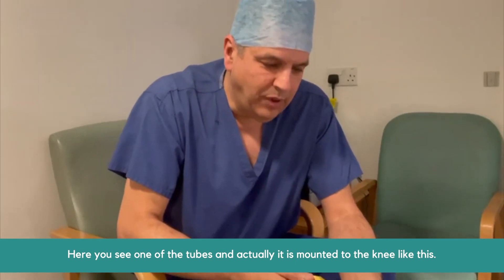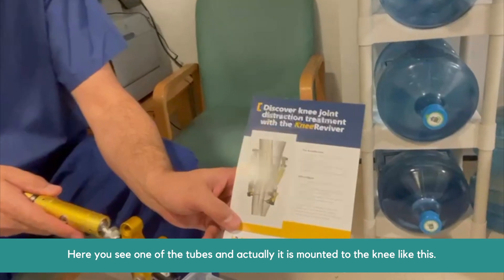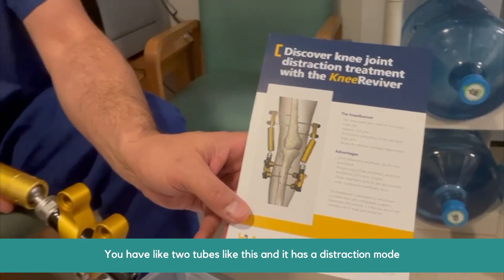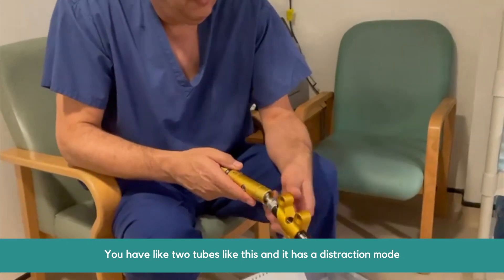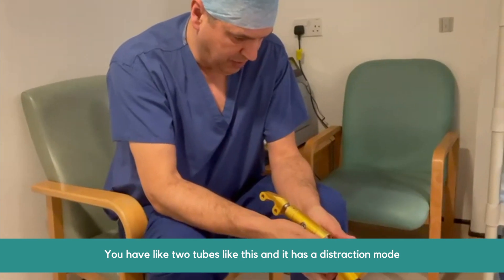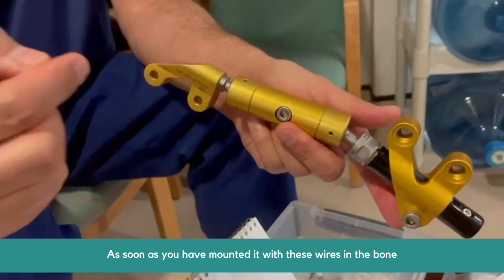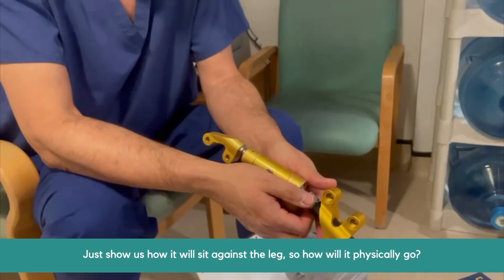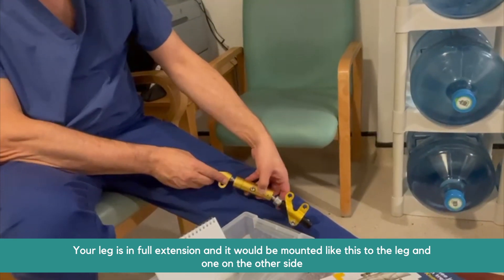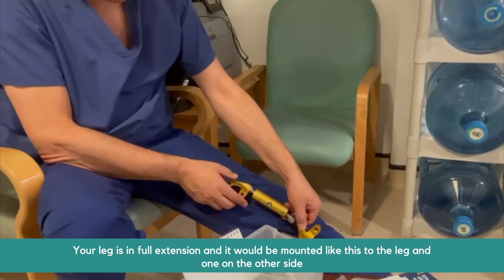Here you see one of the tubes and it's mounted to the knee like this. You have two tubes like this and it has a distraction mode. As soon as you have mounted it with these wires in the bone — to show how that would sit against your leg — your leg is in full extension and it would be mounted like this to the leg, one on each side.